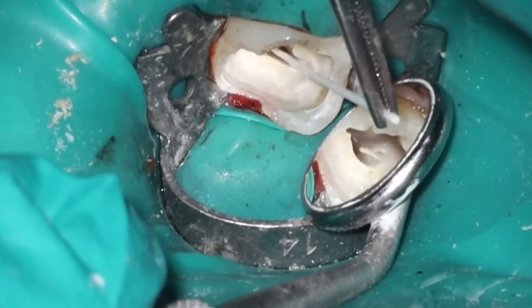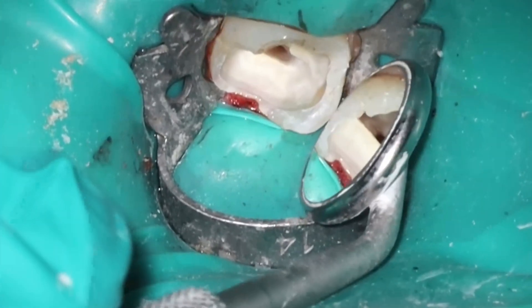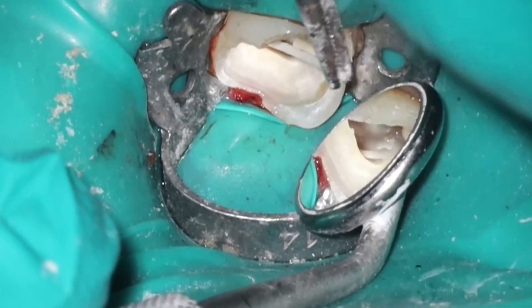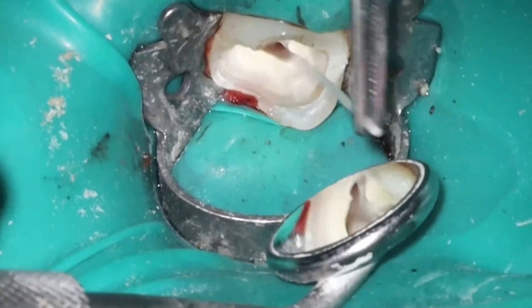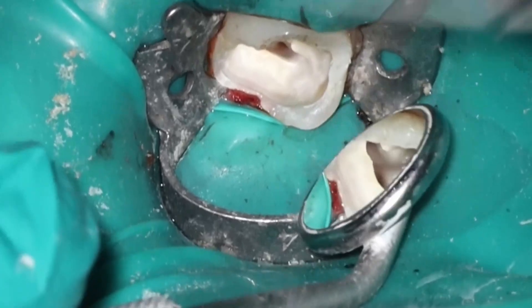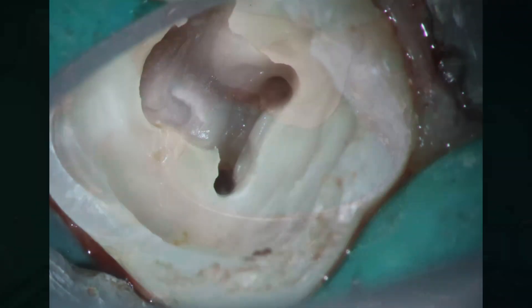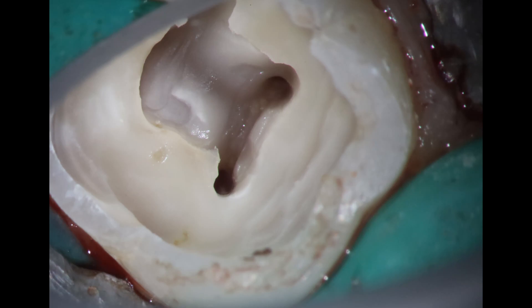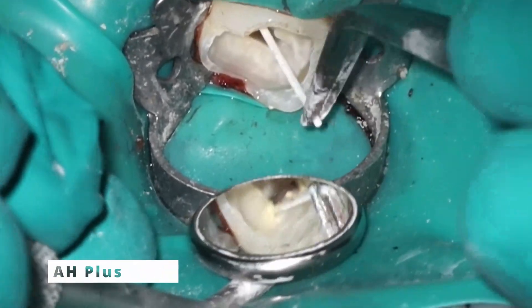So going to use the squirt technique for this. This is a great case for the squirt technique because of that curve — it's very easy for the gutta percha to follow that curve nicely and get a good seal. Sometimes you'll find if you're using warm vertical or a single cone that the curvature on these cases is a little bit more steep than you would think. But that's what it looks like when it's all cleaned out — no bleeding, which is fantastic. So we're going to go ahead and fill these teeth up now using AH Plus and the squirt technique.